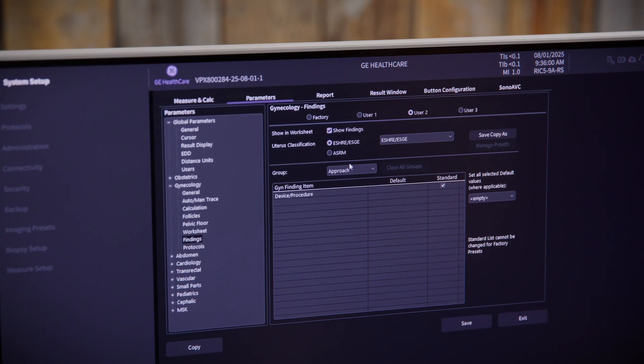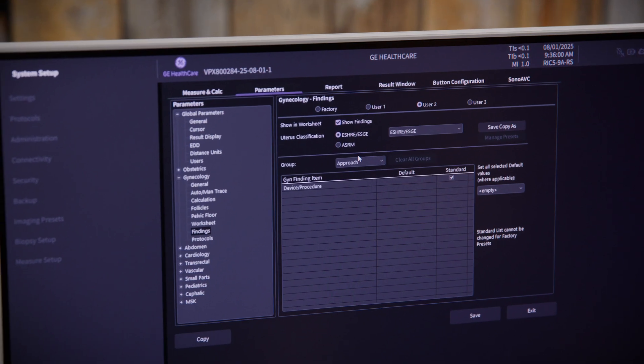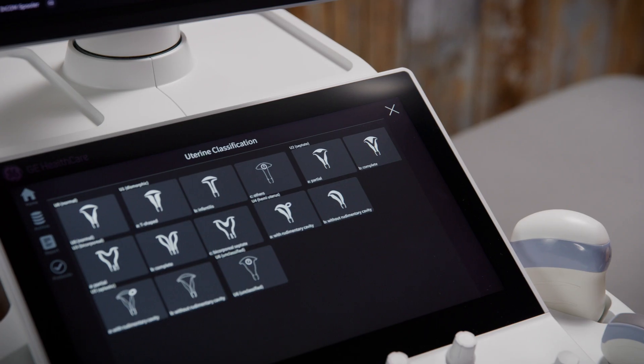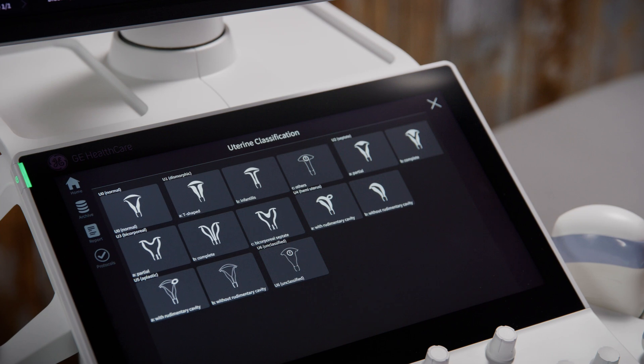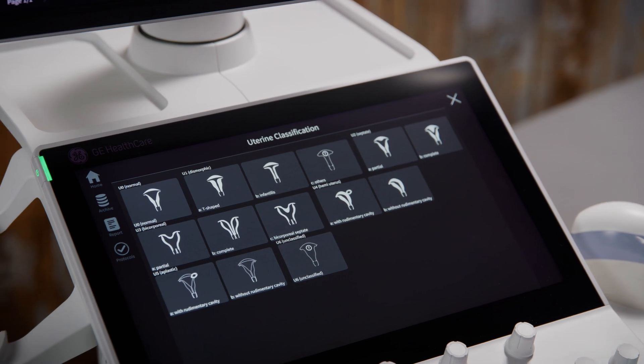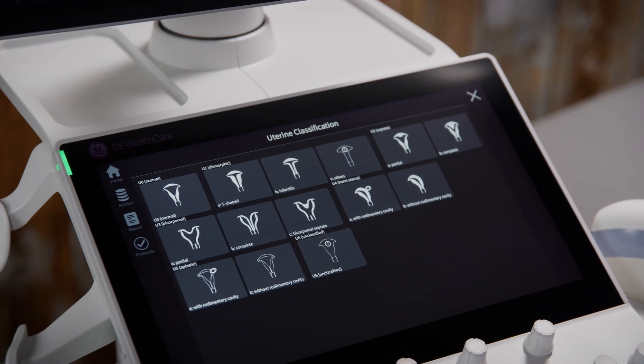Uterine trace also links directly to ASRM, ESHRE, and ESGE classification guidelines for standardized documentation of uterine malformations. So whether you're evaluating uterine shape, confirming a diagnosis, or just looking to streamline your workflow, uterine trace helps make 3D imaging faster and easier.